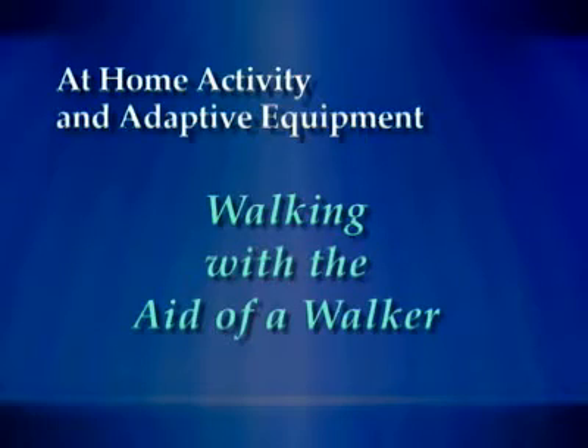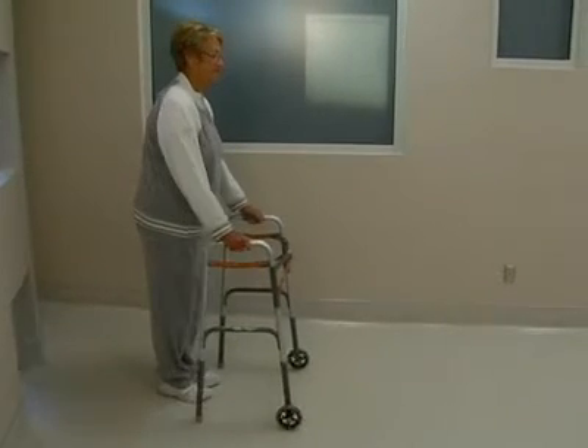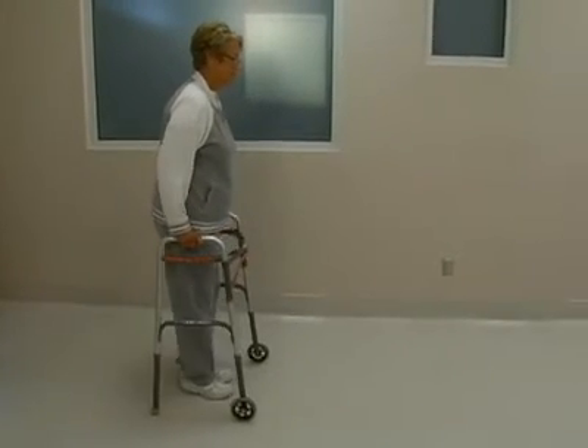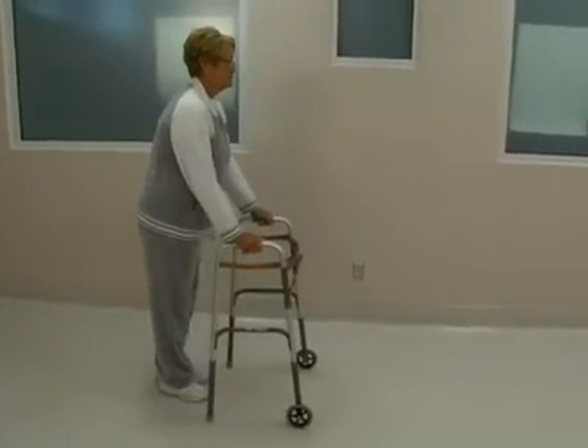Using a walker for walking. When walking with a walker, first advance the walker, then step forward with your operated leg, then step forward with your other leg, supporting some of your weight with your arms on the walker as needed.